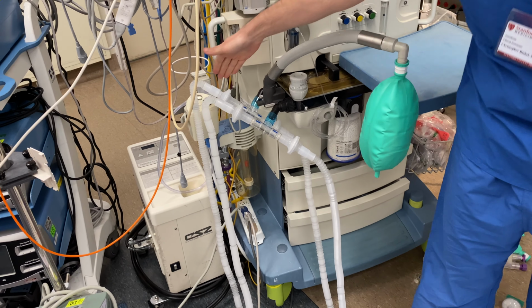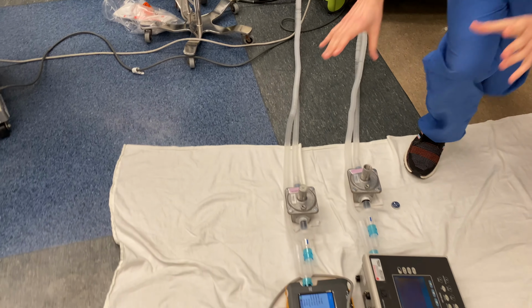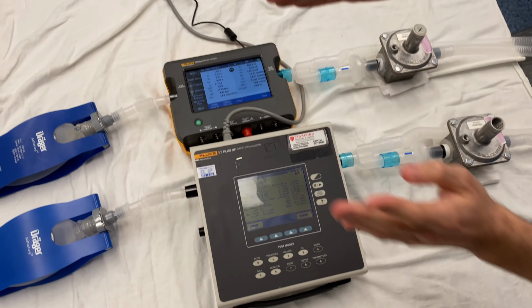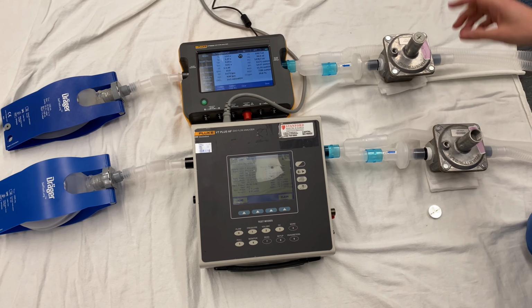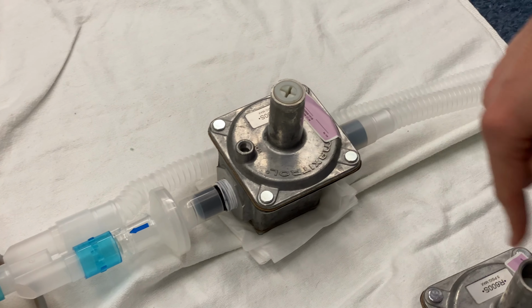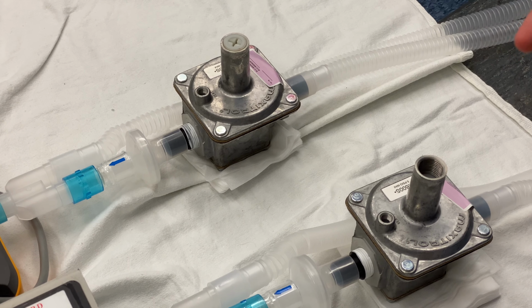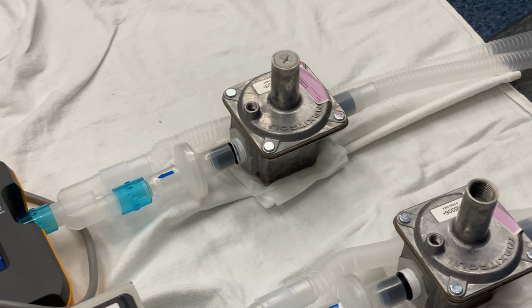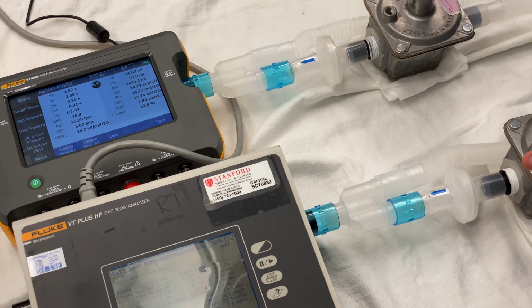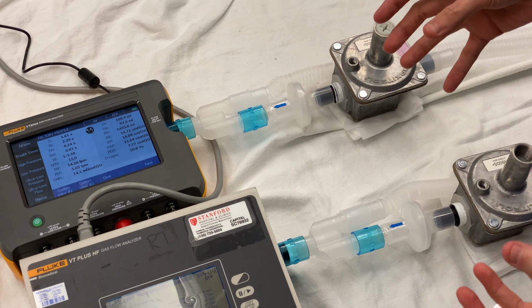So from here, continuing down the inspiratory and expiratory limbs, we have our two pressure regulators on the two inspiratory limbs for what we call patient A and patient B. So these pressure regulators have a standard Phillips head screw that adjusts the pressure that's allowed to be sent through to our simulated patients. And I'll show you a demonstration with that in a minute. We have another filter and another one-way valve. Again, this is important because we don't want these pressure regulators to become contaminated with anything from the patient themselves.